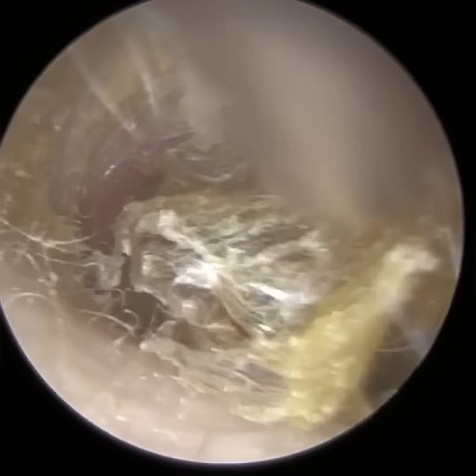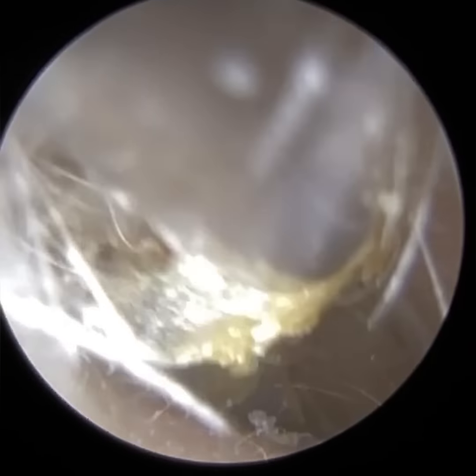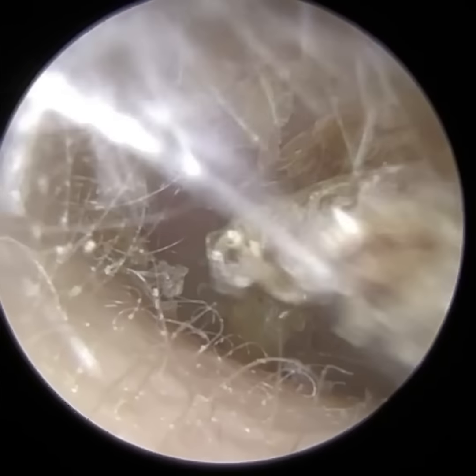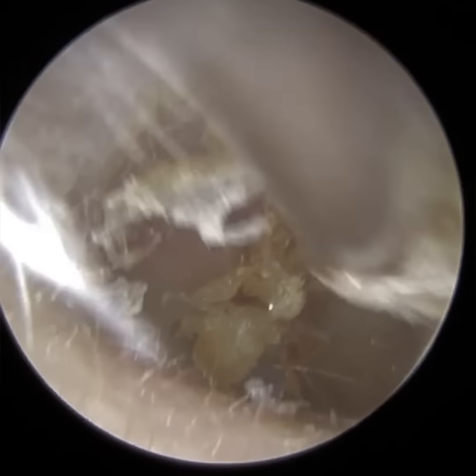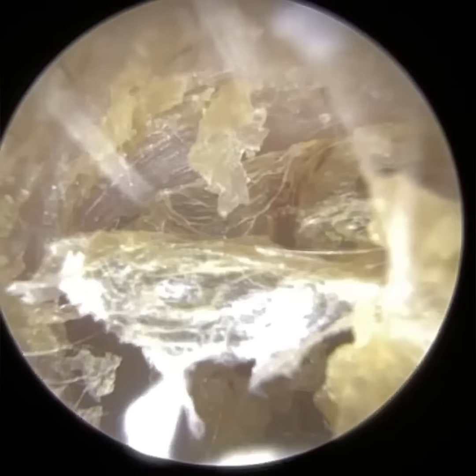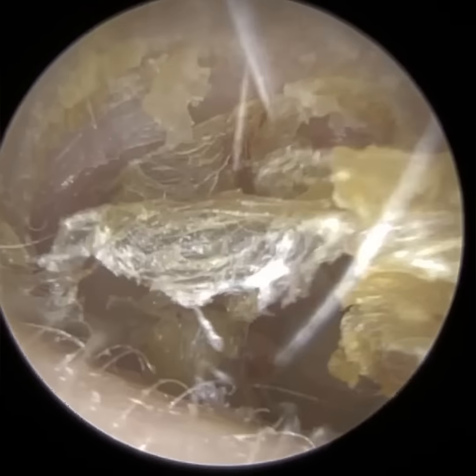With regards to the eardrum, I always compare it, if you've been watching my videos for a while, I've used this comparison before. Imagine you're stood on top of a little puddle or pond and you drop a pebble right in the middle. You have those ripple effects. Imagine the pond or the puddle being the eardrum. Imagine those ripple effects being the dead skin. So it originates from the middle of the pond, and these skin cells migrate laterally, so sideways and towards the entrance of the ear. And as they do, they line the ear canal, so it provides that epidermal layer.